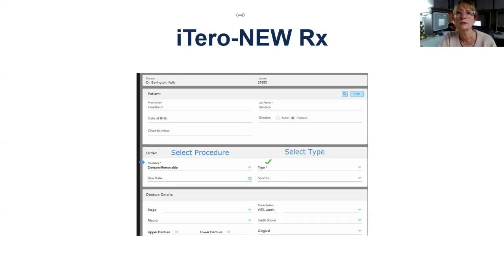With cases on a lower mandibular ridge, as I pointed out, do you recommend, sorry, it jumped on me. Do you recommend to have a soft acrylic instead of traditional hard material be used on the ridges? For the final, I think that's Dr. Spivak. I'm not sure if you're referencing the soft acrylic as the final denture. I know IvoCap, an Ivoclar product, used to have flexible flanges on mandibular dentures. I don't believe that is still a product out there, but I could double check that.